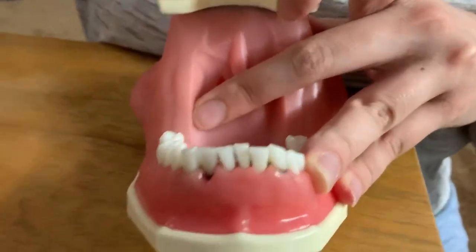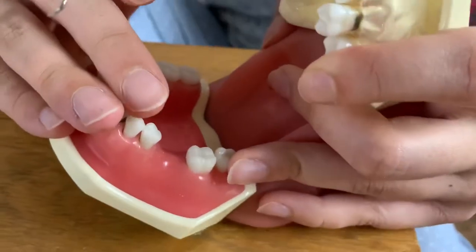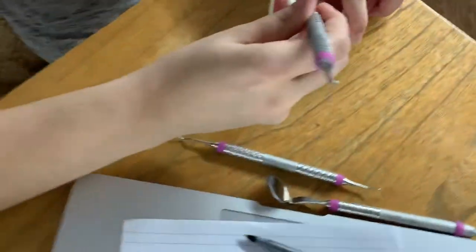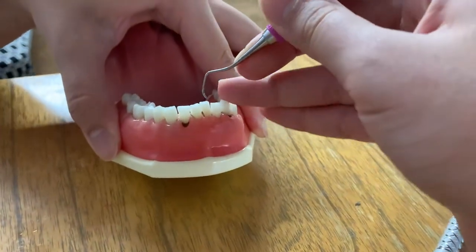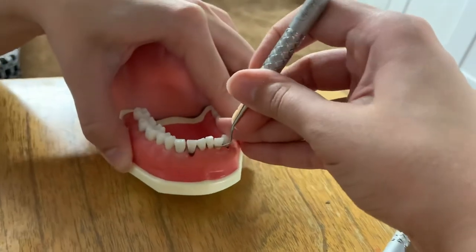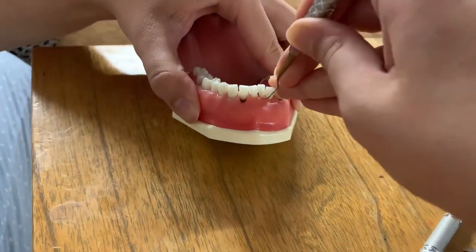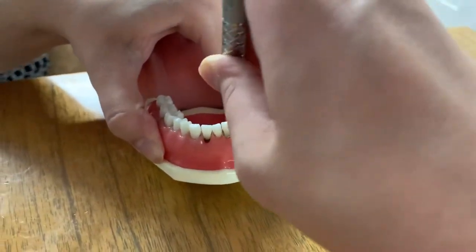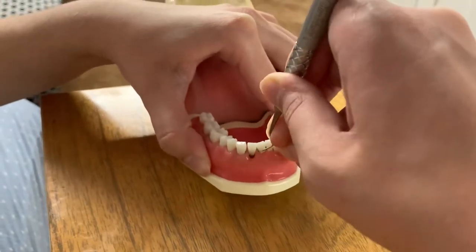I'm going to do the same thing for the mandibular teeth. For this one, I'm going to sit as though I am in an eight o'clock position. I'm going to work right over here on these two teeth. I'm working on my toward surfaces, so the Pac-Man needs to work as though it's coming towards me. We're going to start right over here at the midline of the tooth and properly fulcrum. It's a little more difficult because this patient has some crowding — very limited amount of space — but I'm still going to work towards myself and end up interproximally.